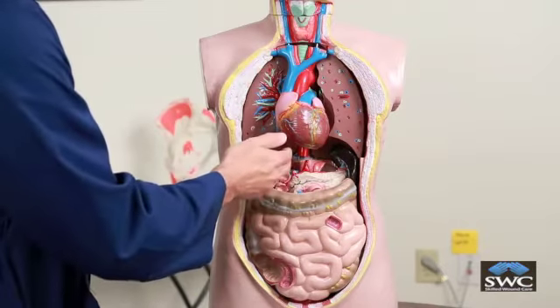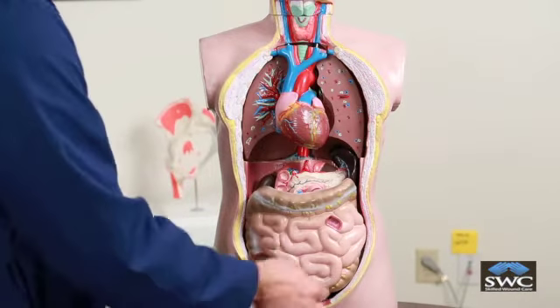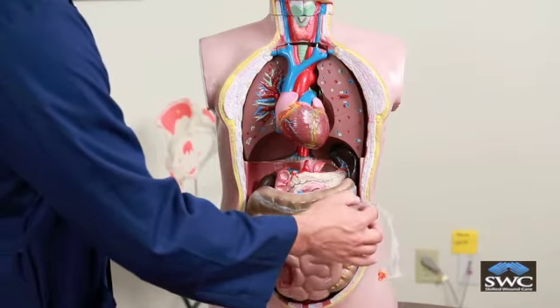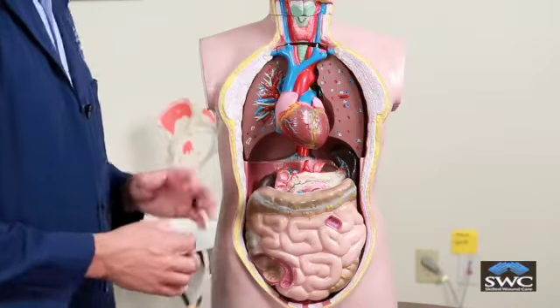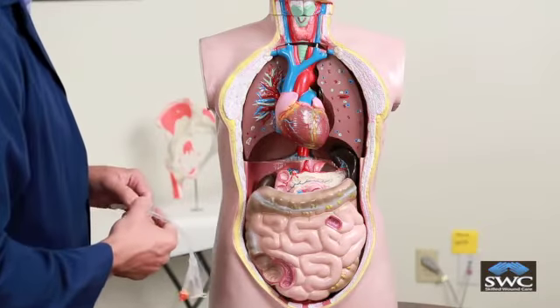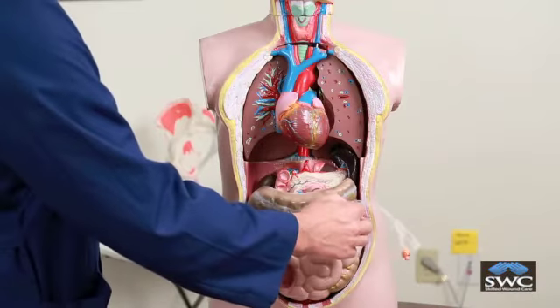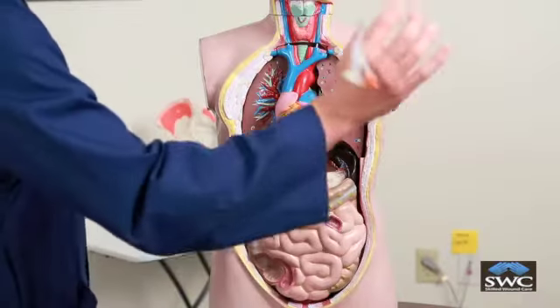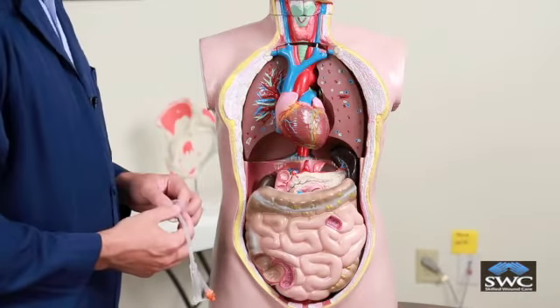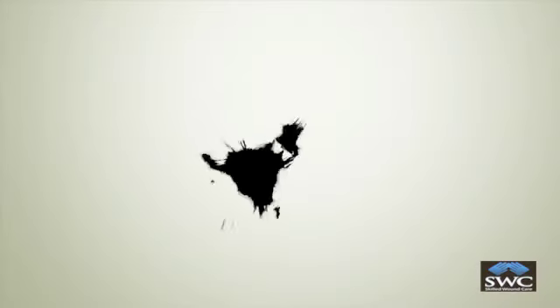So this is your stomach. Your stomach leads to the duodenum with the jejunum and ends at the ileum. And when we place a jejunostomy tube, we're actually placing it directly into the patient's jejunum. We can do this through interventional radiology or through an actual surgical procedure where we take the patient to the operating room. In all instances, if you have a jejunostomy tube that comes out, never try to blindly replace a jejunostomy tube. This is highly unorthodox and should never be done.